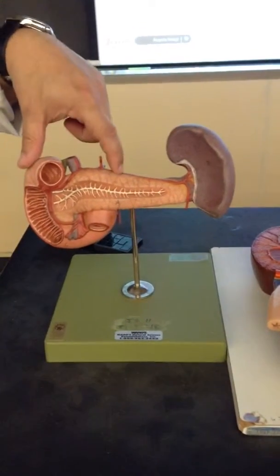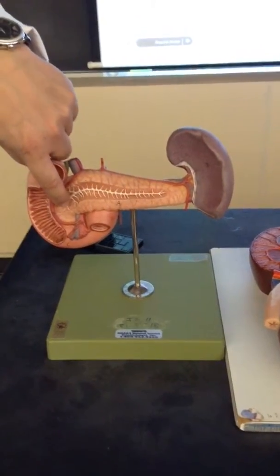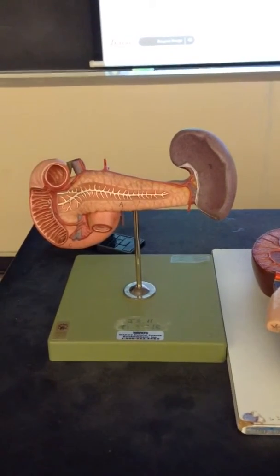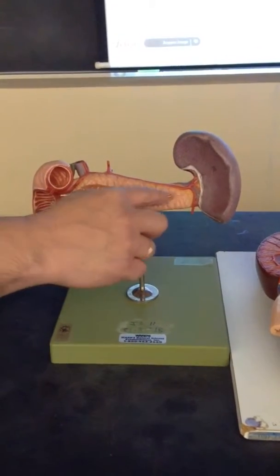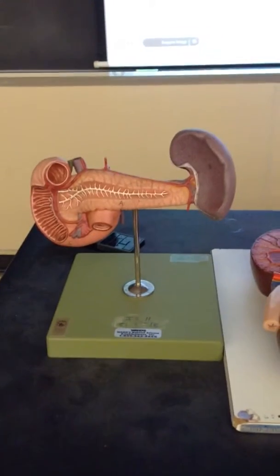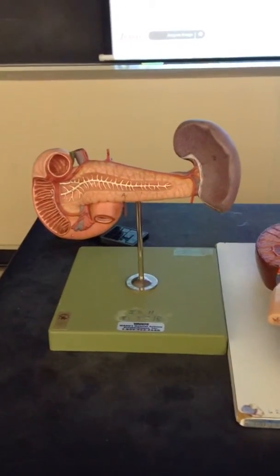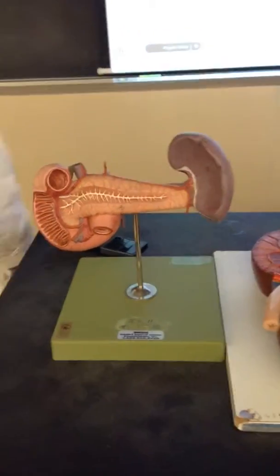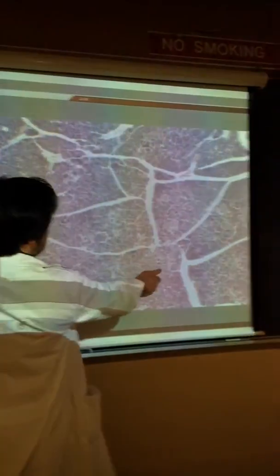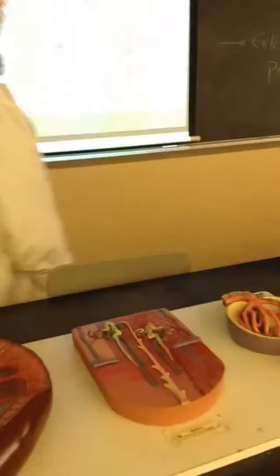As an exocrine, it's secreted into the duct, and the major duct, this one right here, is known as the pancreatic duct. But scattered along the pancreas are regions that are lighter, paler staining. Here's one region like that, so keep an eye out for that. That is known as the islets of Langerhans. Looks like an island, if you will.